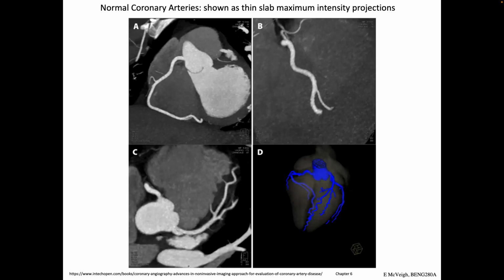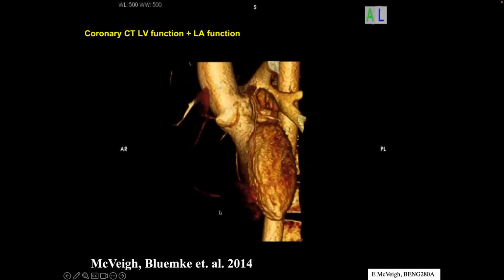In Europe, like in Britain, because all imaging is a cost item, it's not a revenue item. There, if you go into the hospital and you have chest pain, the first thing they do is a CT, just like, let's see what's going on. Boom, because they can most efficiently get you into the right pathway after that, you know, for the lowest cost. So this is CT of these coronary vessels. So if there is an abnormality in one of these vessels, it shows up pretty easily.